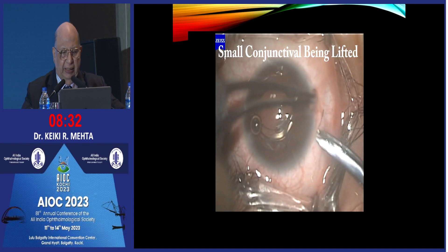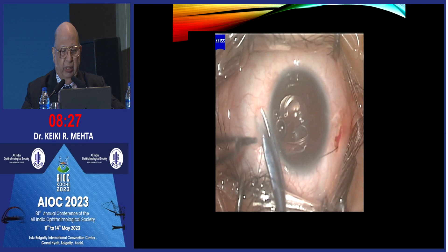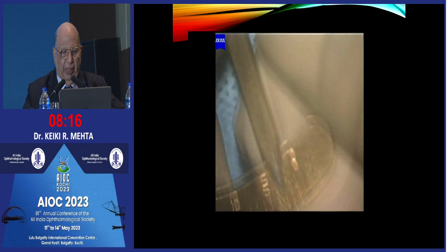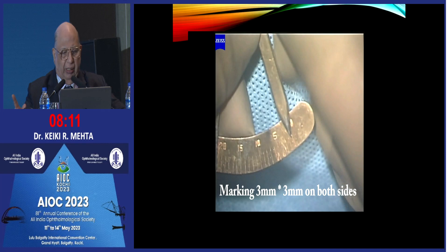There is really no way you can fix it; there is no way you can suture this bag anywhere — everything is going to drop. So we start off by doing a small conjunctival flap being lifted. We are using a little of the sclera on both sides. Remove any debris which may be there, prepare it and leave it as that.